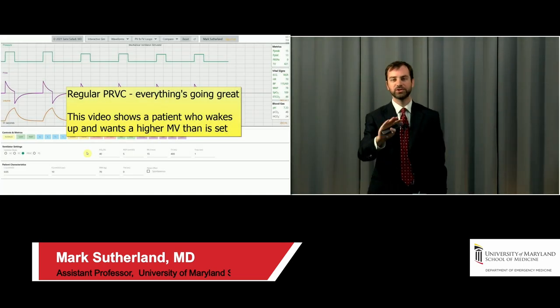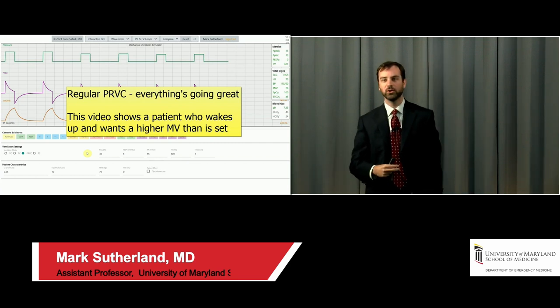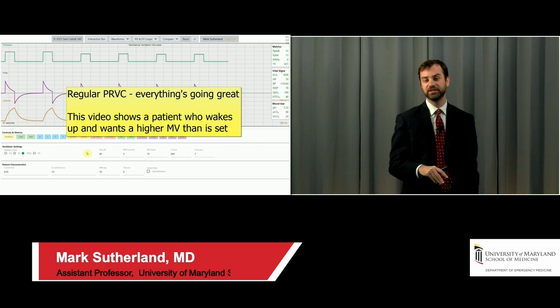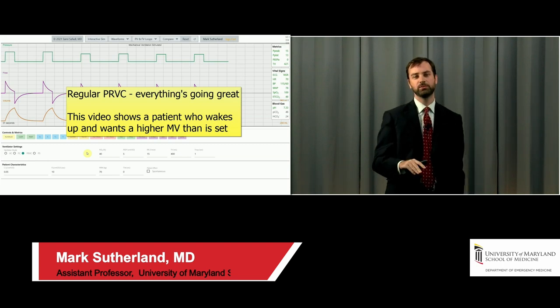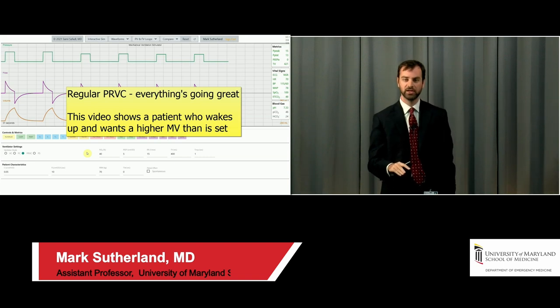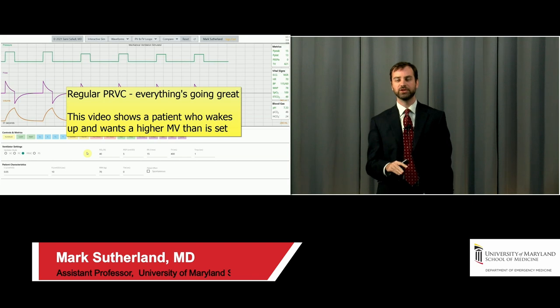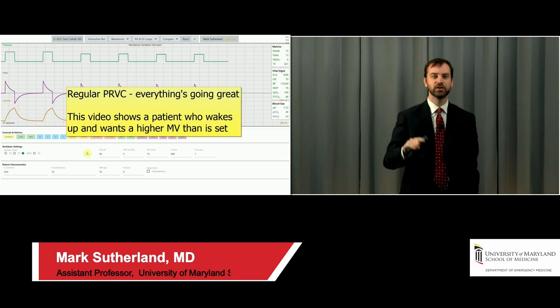All right, so before we start this video, this is another video from Sammy's website. I want to talk briefly about something I call the PRVC vicious loop. This is one of the big drawbacks, I think, of pressure-regulated volume control, and I think a lot of people aren't aware of this. It absolutely is something you need to be familiar with because it can cause problems with your patients on PRVC. So the clinical scenario is this.